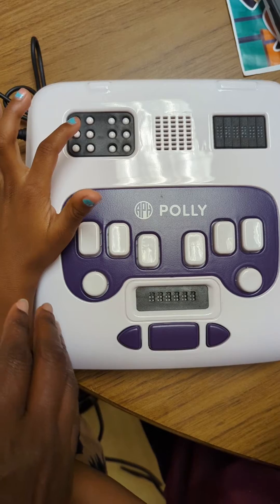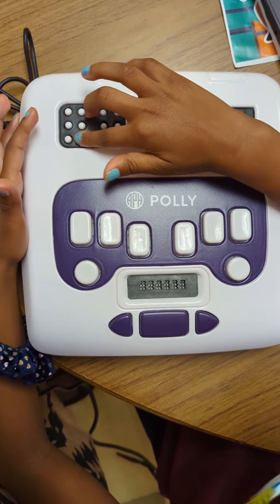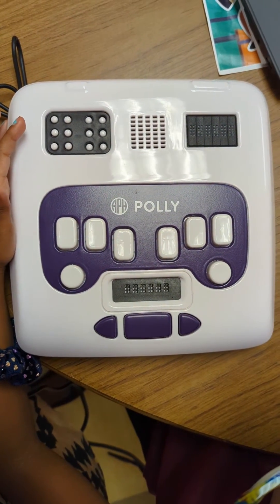On the first large braille cell, press dot six. Wonderful, you got that right.